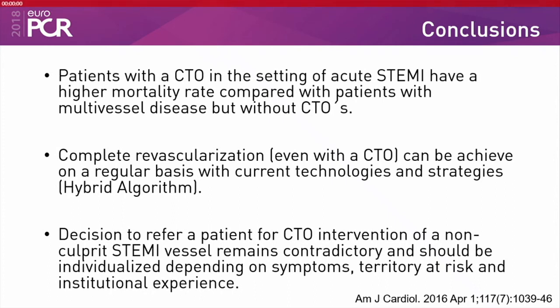But we changed the way we do it, because I guess the way that you do the thrombus aspiration is what changes the mortality. And when you see a lot of thrombus burden, I don't think that anybody is happy to just put a balloon in while still seeing the thrombus washing away. So we perform thrombus aspiration. I can't say routinely, but we do it very frequently.